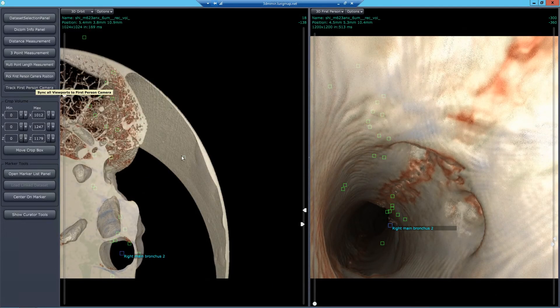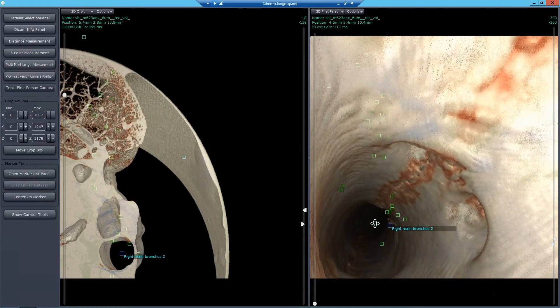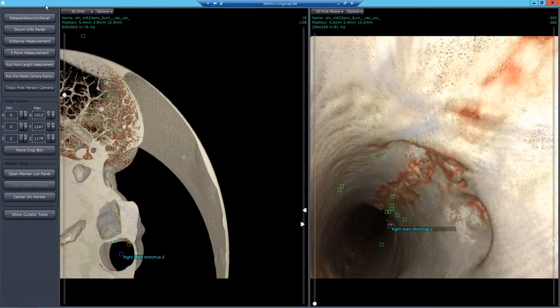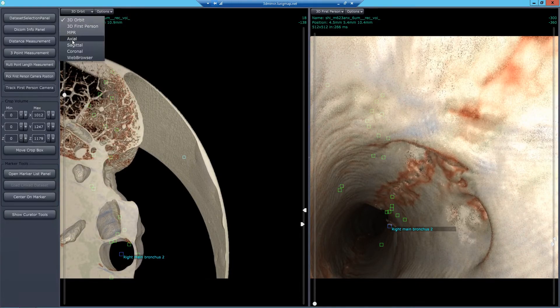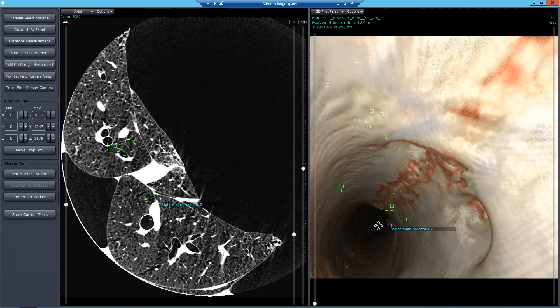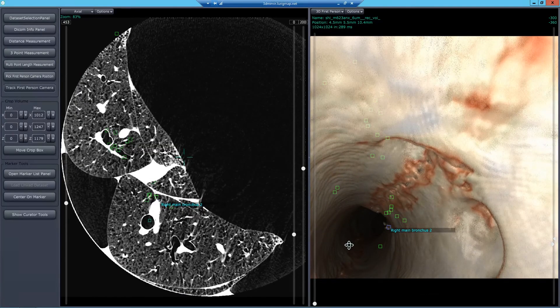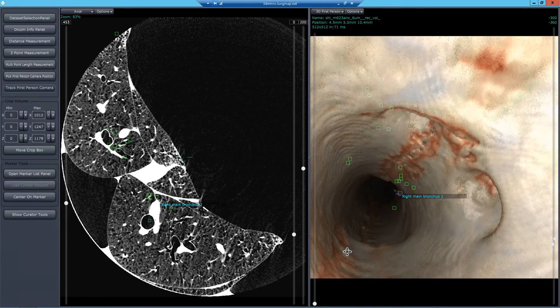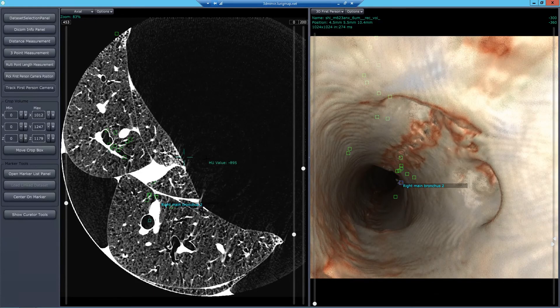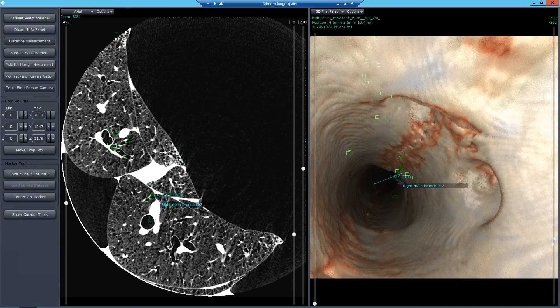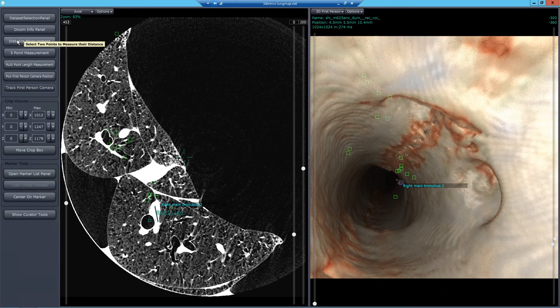We can track where the first person camera is, which is very useful in all the various views in the other window. As you move that first person camera, the view and the slices in the other window will move with you. Once you're there, you can use measurements and other tools depending on what you're looking for.